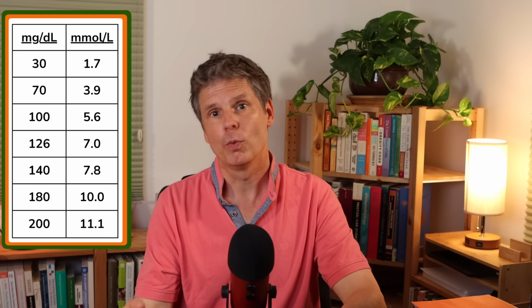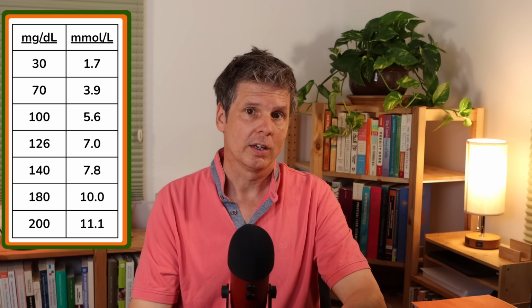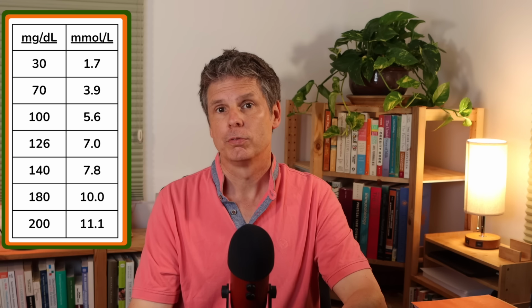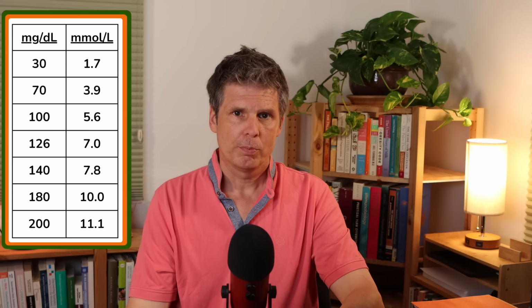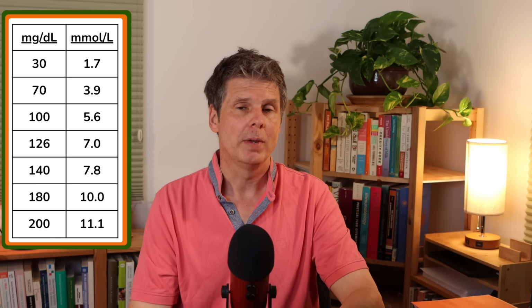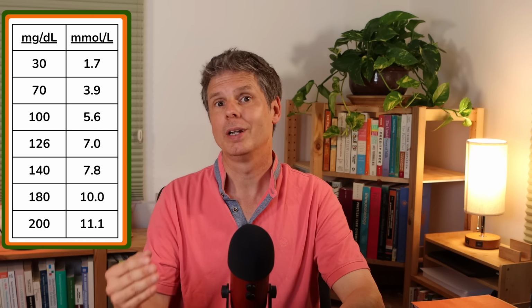So again, if you want to use your CGM to understand what your glucose tolerance is like, you can do that only if your meals contain at least some carbs, for example in the form of grains, starchy vegetables, or fruit. It is also important to understand that following a low-carb diet in general will make you somewhat glucose intolerant temporarily, because your body will release less insulin on an occasional cheat meal rich in carbs.